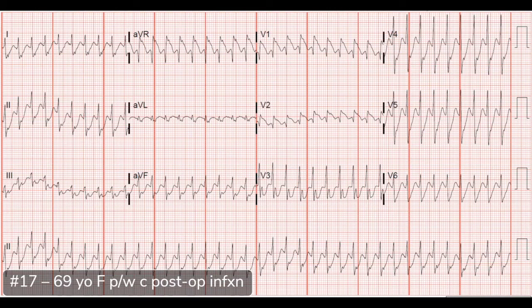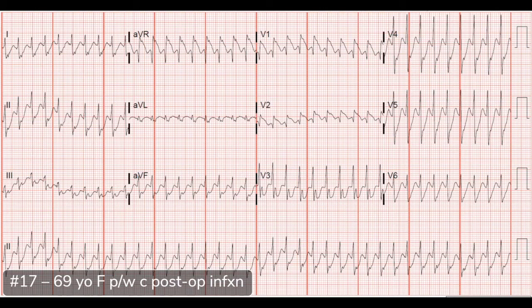There are also ST changes — elevation in V1 and V2, and depressions out laterally and inferiorly — that's probably rate dependent. Unless you cardiovert her, get a repeat ECG, and still see those changes, that would be more worrisome. It's hard to say exactly what this is, but the treatment is clear: electricity.